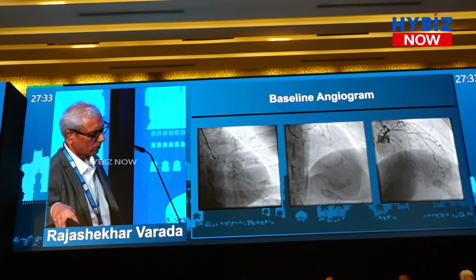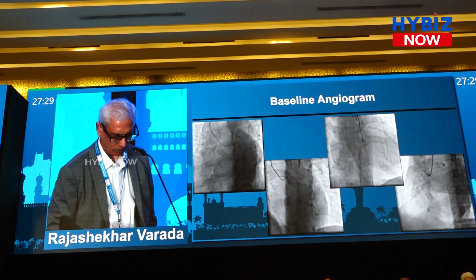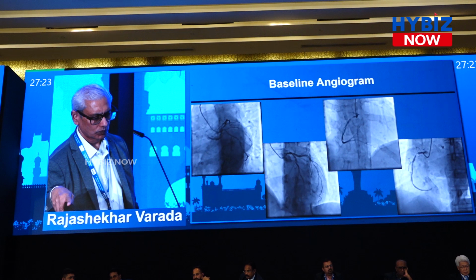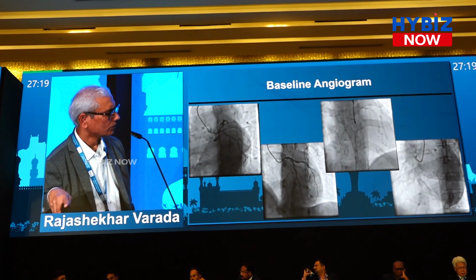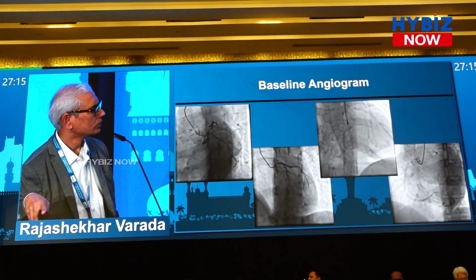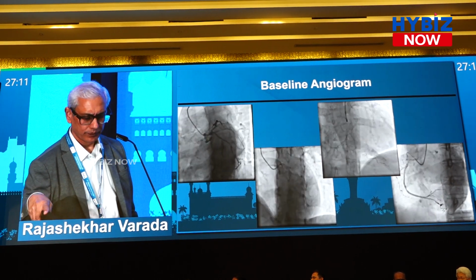And RCA, I couldn't see. Where is RCA? Again, RCA, the imaging, and it looks really calcified, maybe a rota to RCA. Cutting balloon, followed by stent. First go for RCA, then LAD.